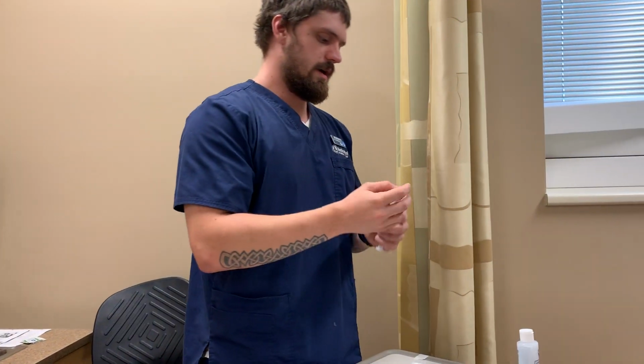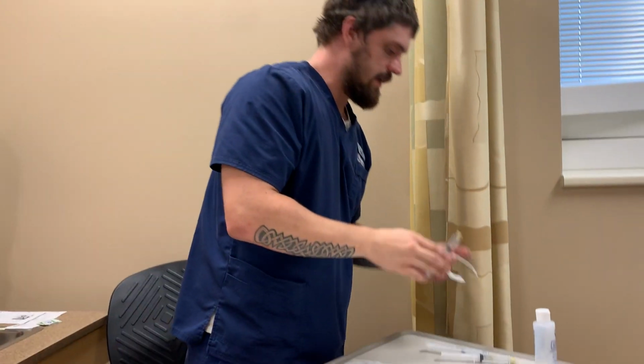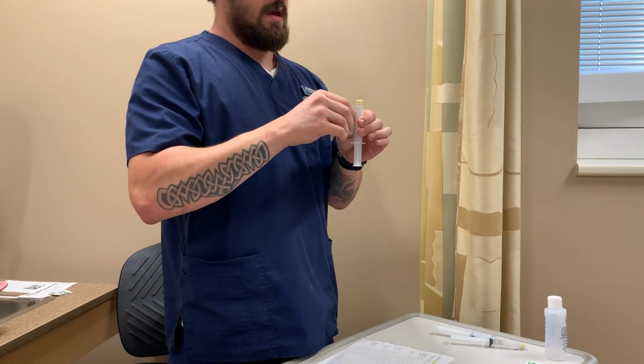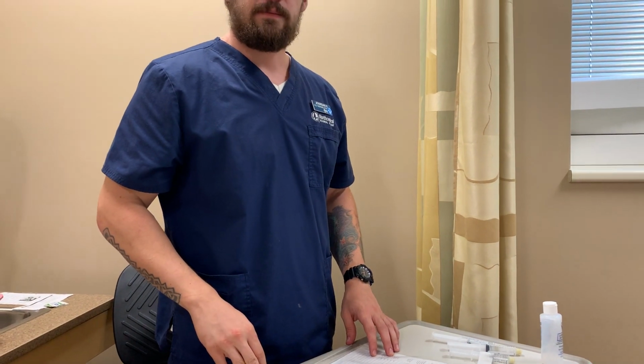So we will put our cover back on after we push the air out, making sure not to waste any med because it would be inaccurate to know how much was wasted. And all the air bubbles are out. And immediately labeling the med with the date, time, our initials, the client's initials, the drug inside, and the dose. We are ready to head inside.